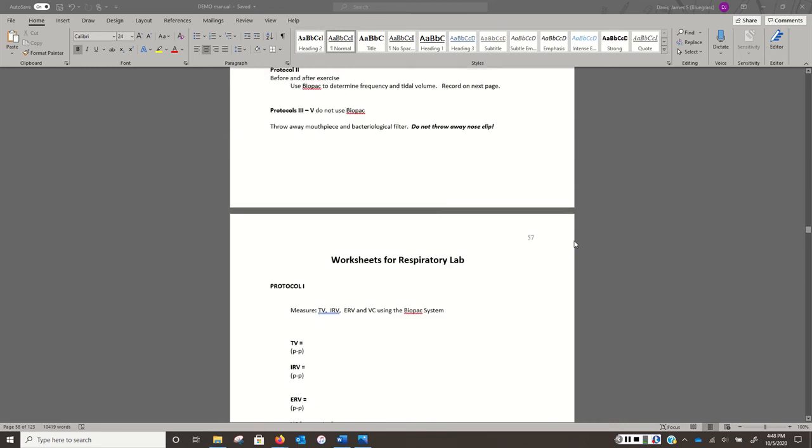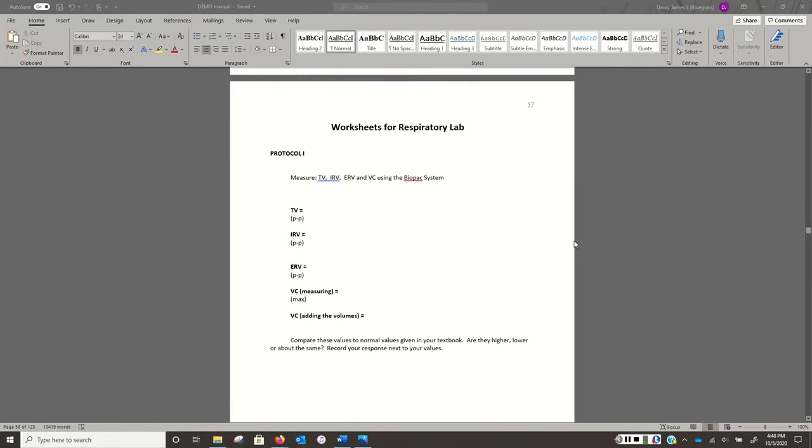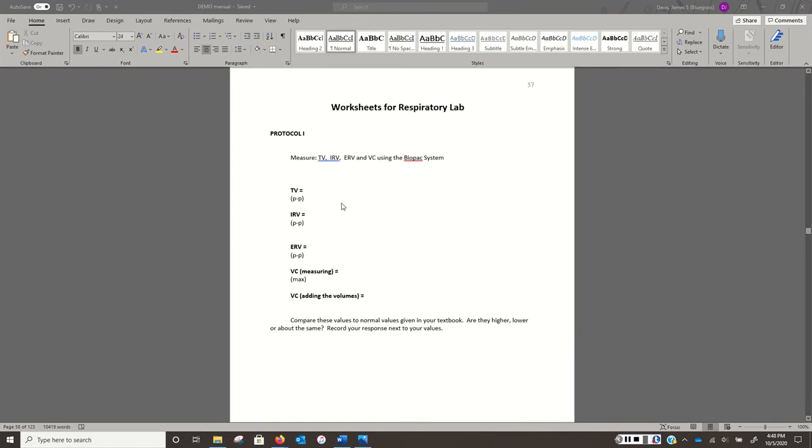There is a little bit of information prior to this, but this is where the actual work begins, and this is what I've already done and I'm going to present today. So what we're going to be doing first is using the spirometer to measure my tidal volume, my inspiratory reserve volume, my expiratory reserve volume, and my vital capacity. And then we're also going to calculate vital capacity based on tidal volume, IRV, and ERV.